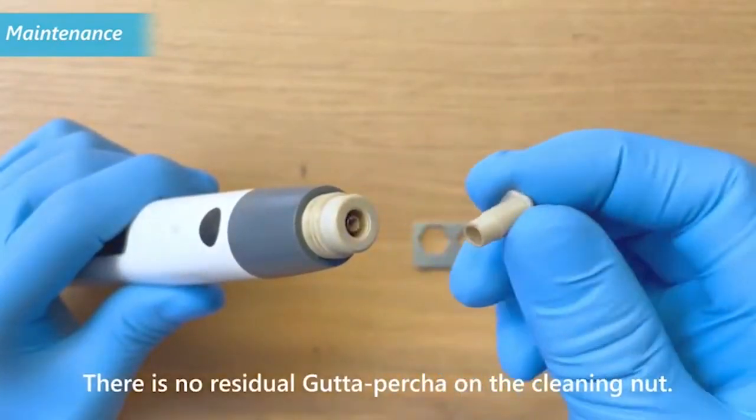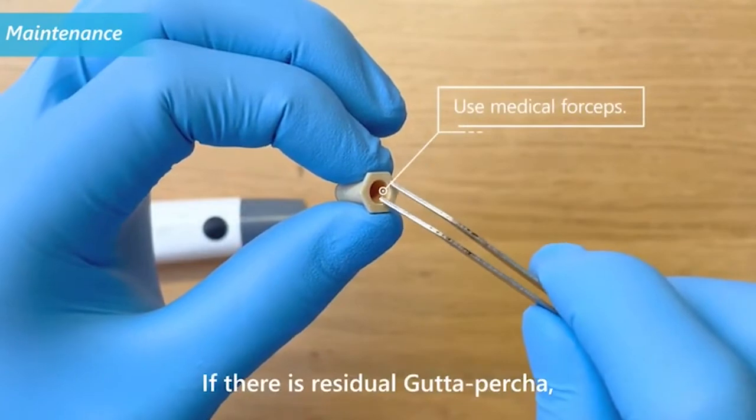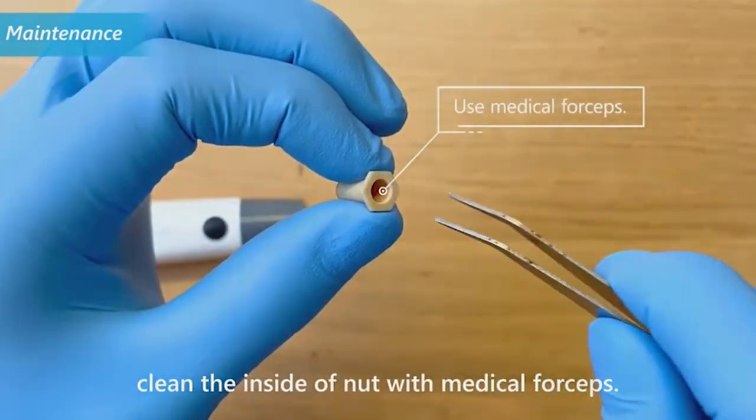Check that there is no residual gutta percha on the cleaning nut. If there is residual gutta percha, clean the inside of the nut with medical forceps.